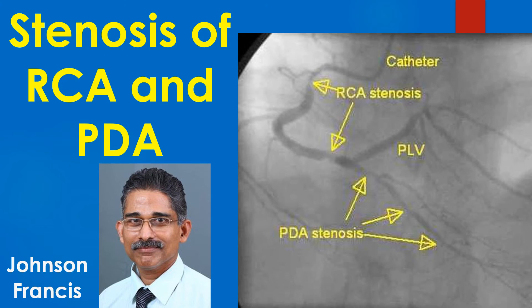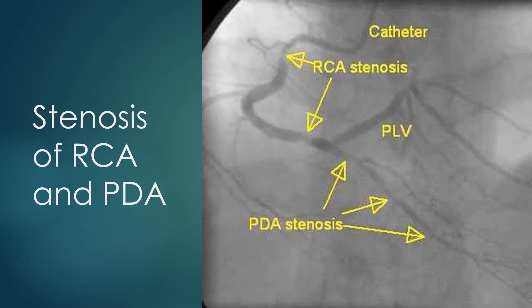The right coronary angiogram shows multiple stenotic lesions. The RCA has two lesions: one in the proximal region and another distally just before the crux, where the posterior descending coronary artery and posterior left ventricular branches originate. This is a precrux stenosis of the RCA. The RCA is also seen to be a bit tortuous.